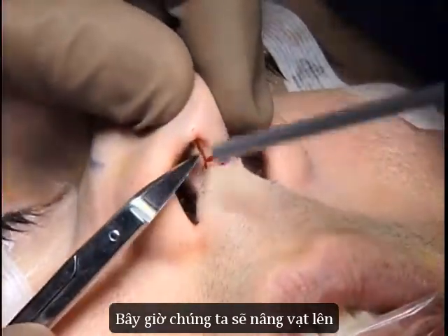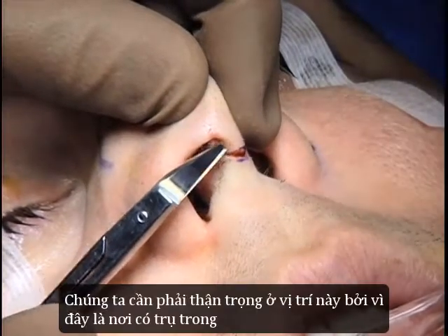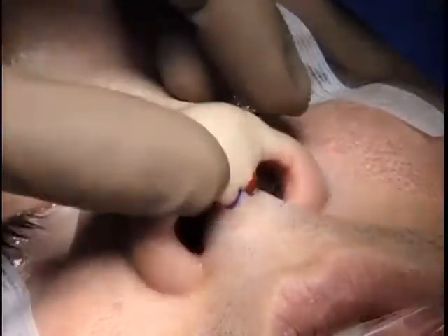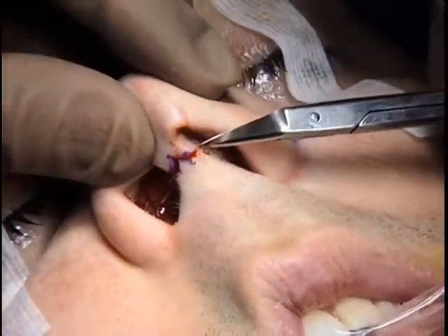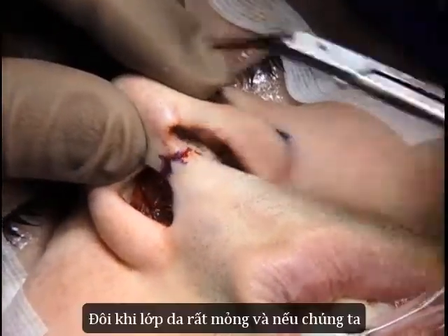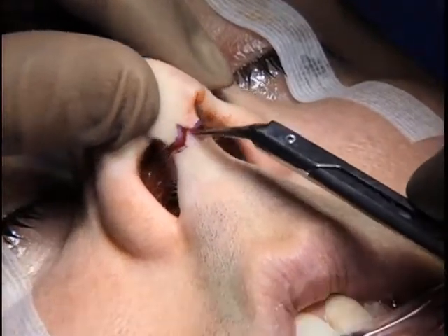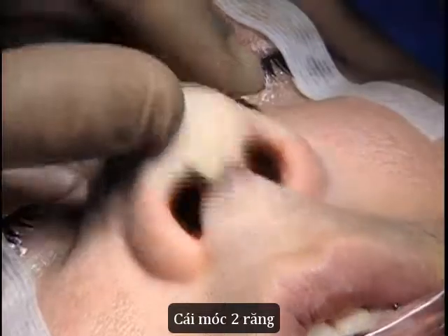Now we're going to raise the flap carefully here because this is where the medial crus sits right underneath that skin. Sometimes that skin there is very thin. And if you're not careful, you can damage the underlying medial crus. Two-prong.